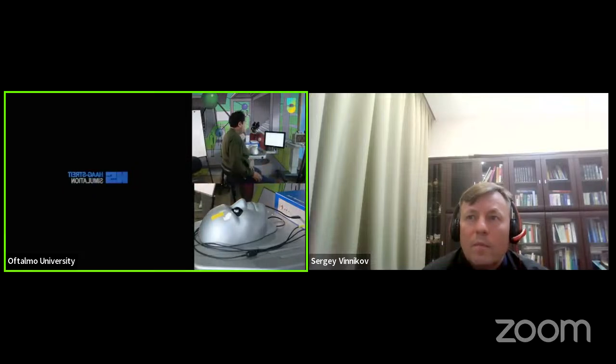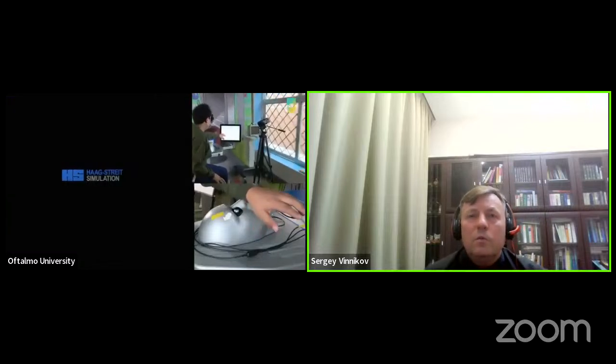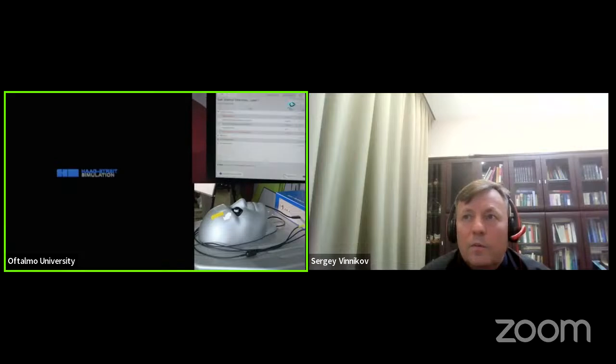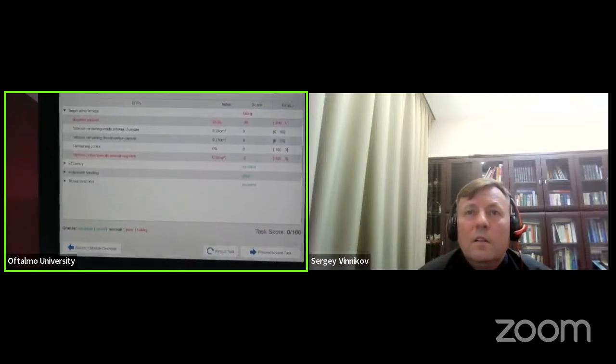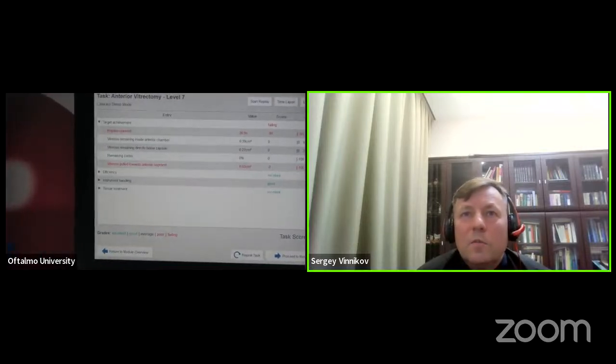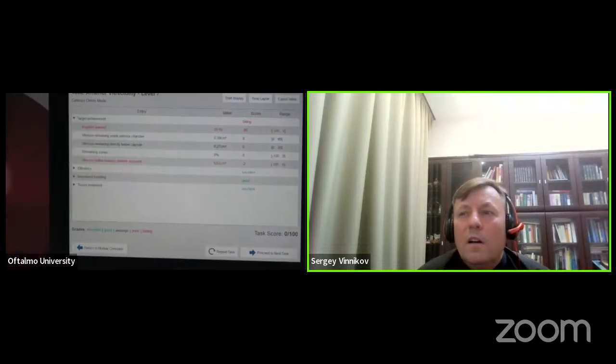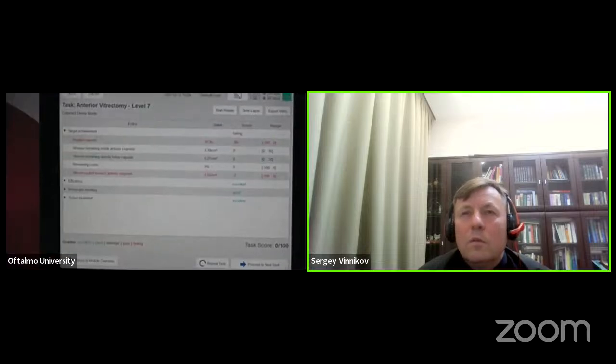Okay, so now let's see the metric. Let's see what feedback the machine gives. Again, look how important it is to have the metrics of how he did.